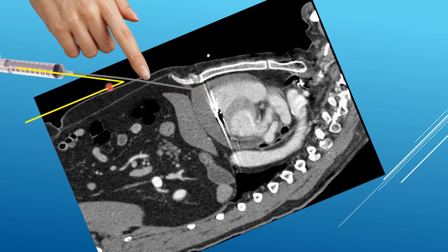And if we were to take a true 30-degree angle without doing that from the start, we would have to go quite a long way below the margin of the ribs. So very often in reality, we take a steeper angle. Now I'm going to exaggerate things a little bit from here on to make the point that I want to.